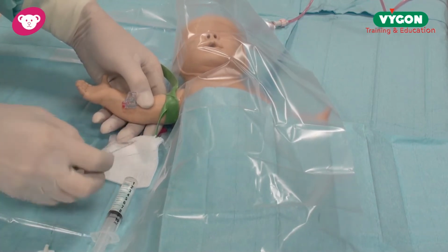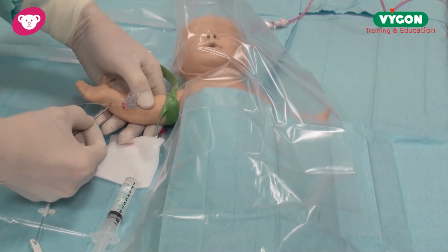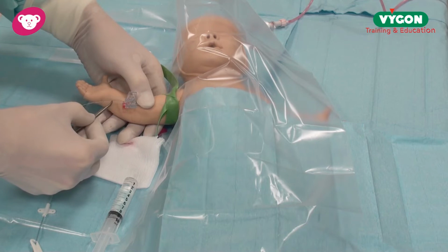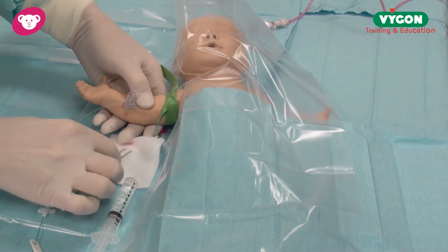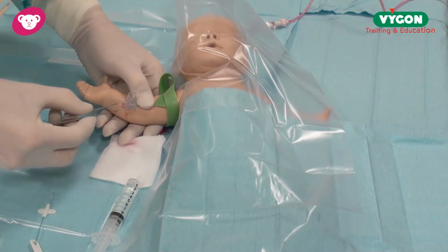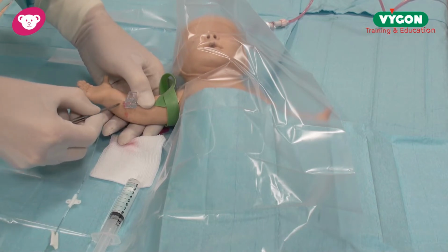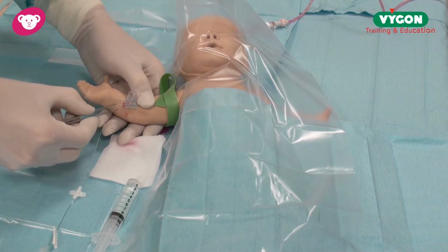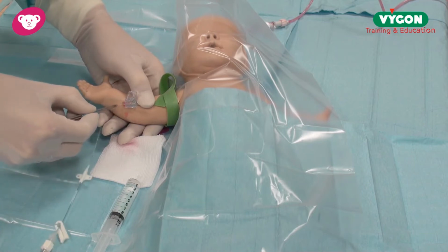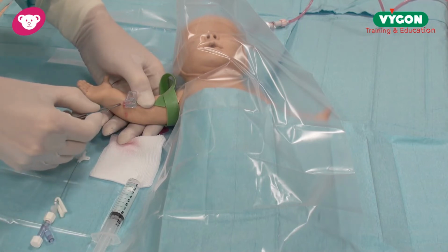Hold the needle in place and then gently advance the catheter into the needle. Nice 1 centimeter push. Now at this point I'm going to release the tourniquet and continue to advance my catheter to the chosen position, and in this case it's 11 centimeters. I'm now at the desired position.